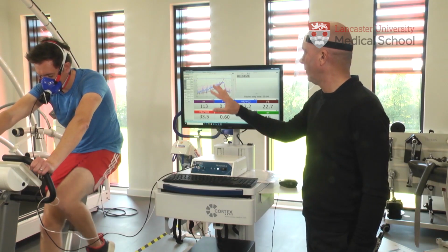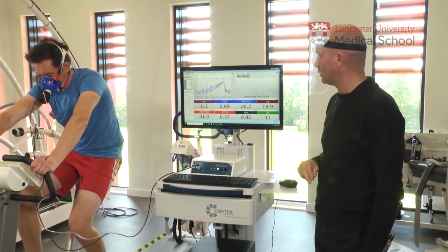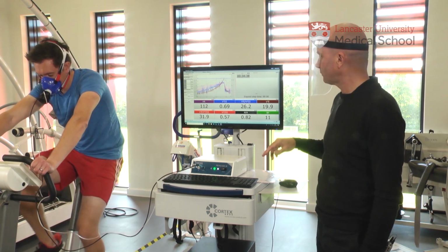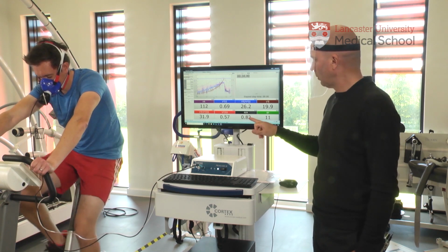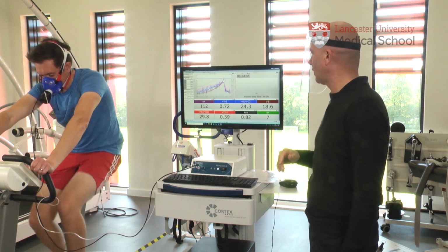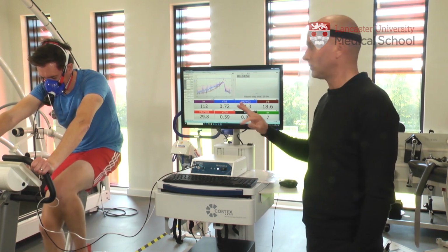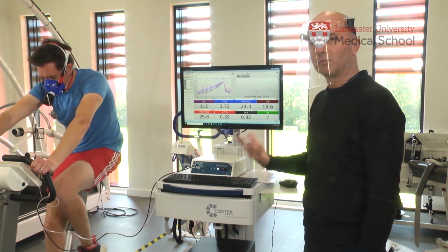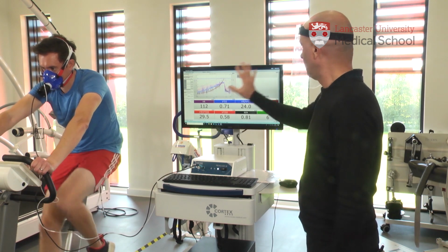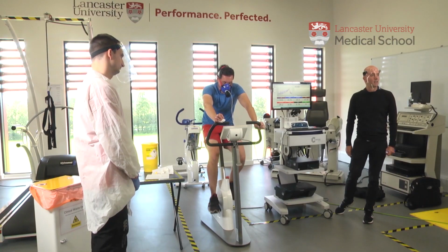We're happy. Looking in the first 10 minutes of recovery, his heart rate's coming nicely down, now up to 112 and coming down. His RER is coming down, 0.82, so we realise now that he's beginning to metabolise fat more than carbohydrate. His breathing frequency is now nice, relaxed, between 7 and 10, which is very near resting breathing rate. And we're happy to say that he's recovered and he can finish the test.